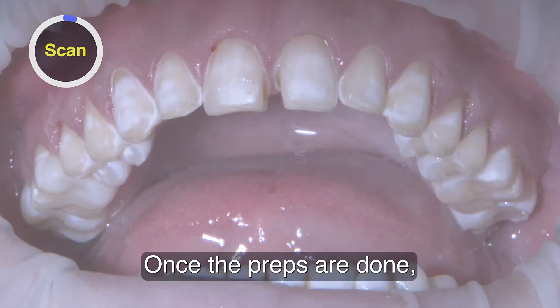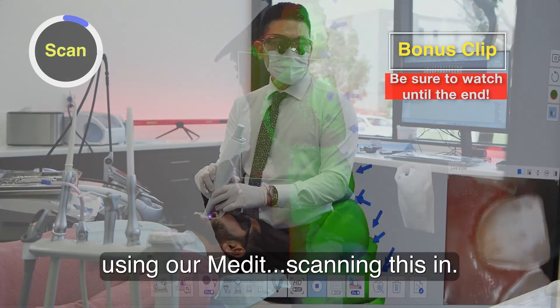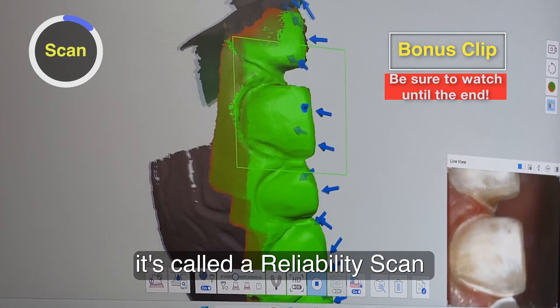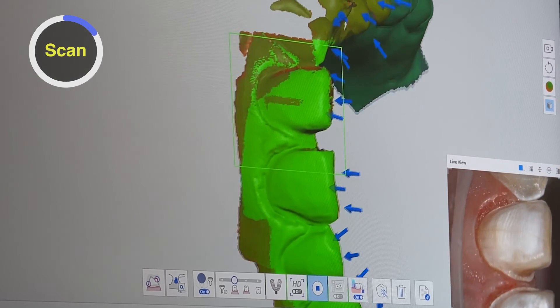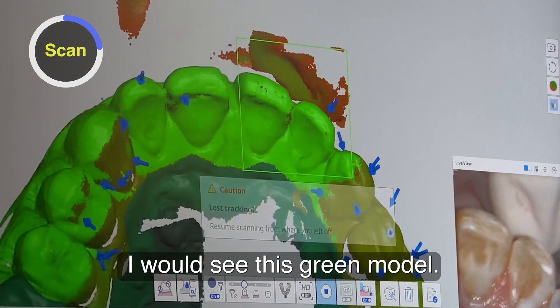Once the preps are done, using our MED-IT, scanning this in — this green model, it's called a reliability scan or reliability map. My assistants were always scanning, and every time they scanned, I would see this green model.